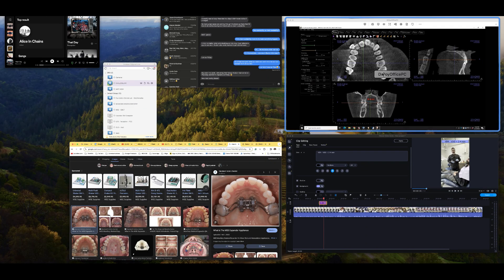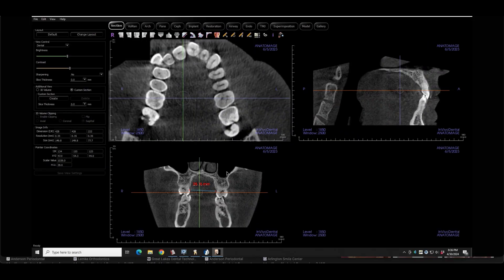The reason I think that's important — if we come over here and look at your CAT scan to give you some frame of reference — this is your nose right here, here's the roof of your mouth, there are your upper teeth, lower teeth, and then the mandible. This slice is a two-dimensional slice of a three-dimensional situation. Right here are your front teeth, this is your airway, and that's your spine. We're about halfway through, and normally the distance between these two teeth is on the order of 40 millimeters. You're at 28.